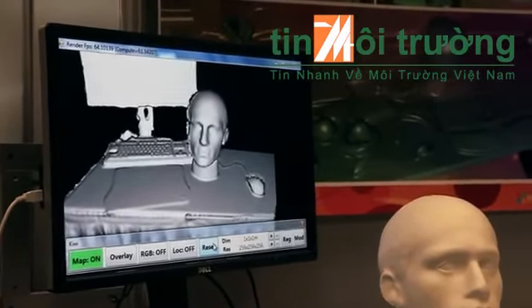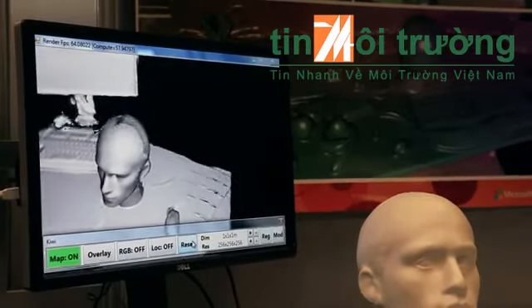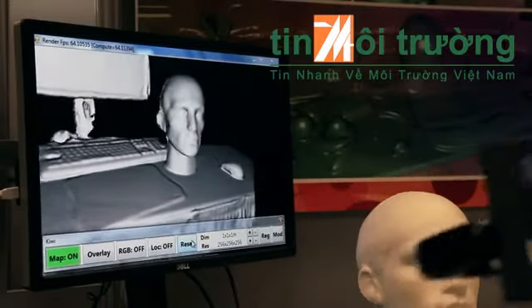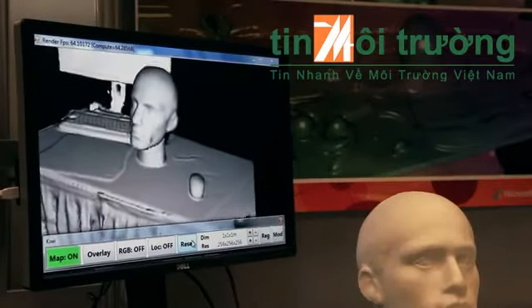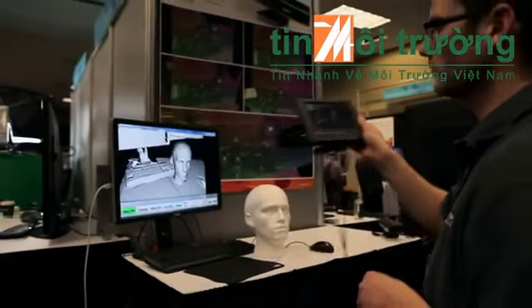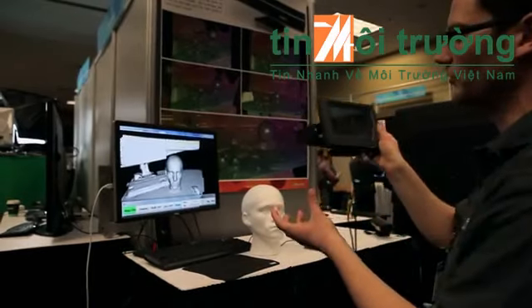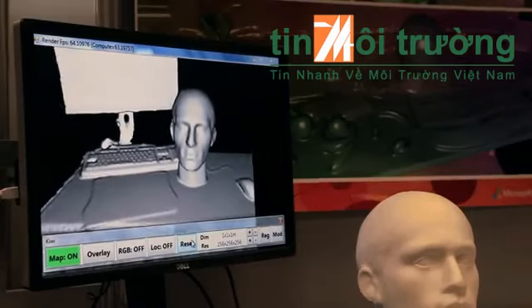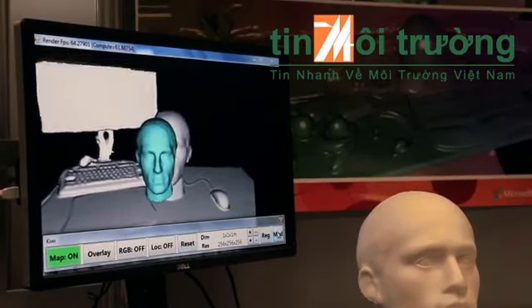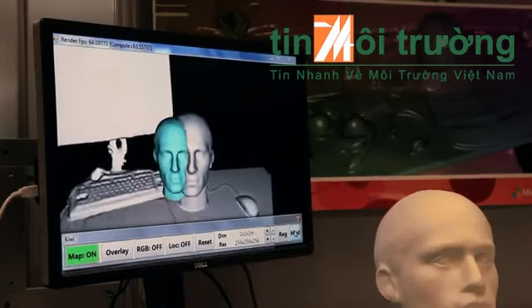So what we built here is a system which builds on top of the Kinect Fusion, which does 3D sensing of the physical world. So basically I can quickly start a scan and move the camera around and get a 3D capturing of the 3D geometry of the patient scan here. So once I've done this, I can load up the scan that has been taken previously before the operation and where all the planning and the diagnosis was done.